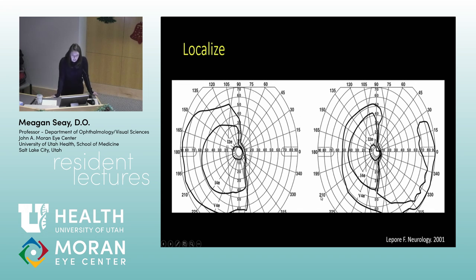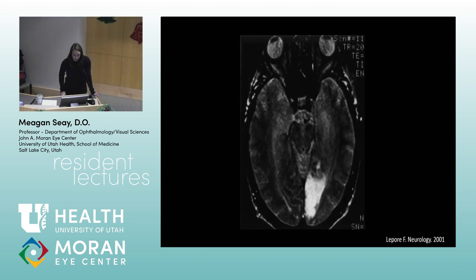So right homonymous hemianopia, because this space is missing, but you've got this thing over here in the right eye, in the very far periphery. So this is called the temporal crescent. And so as we talked about, the occipital lobe is arranged so central macular vision is posterior. Then the more anterior you go is your peripheral vision. So we know that this is the left occipital lobe because you have a right homonymous hemianopia. And then because we're picking up this temporal crescent, we know that the anterior portion of the occipital lobe on the left is spared. So this would be an example of a lesion sparing the anterior occipital but affecting the rest, giving you that temporal crescent.